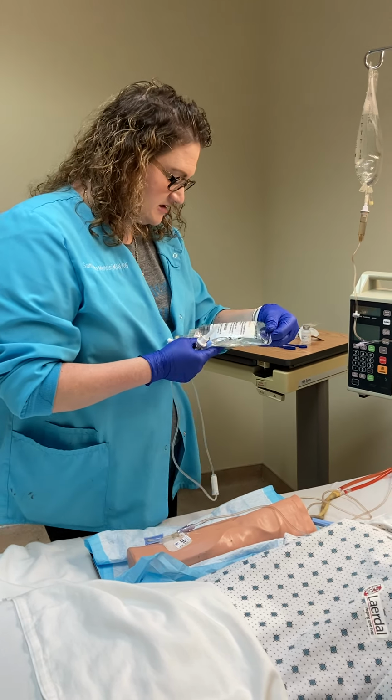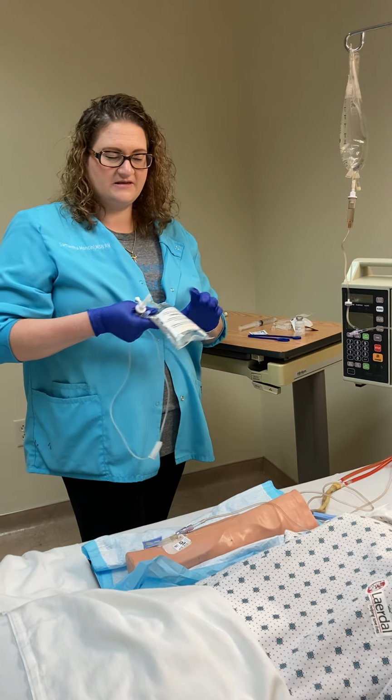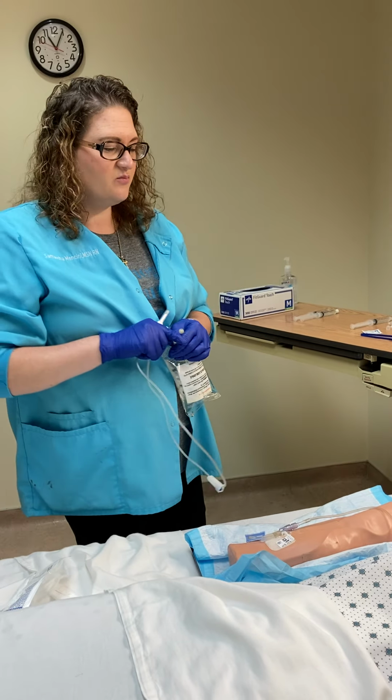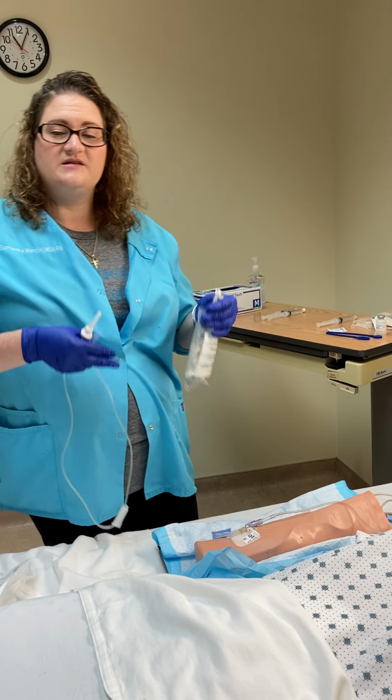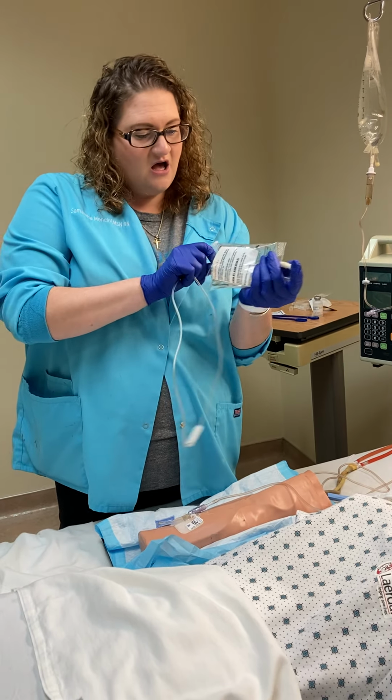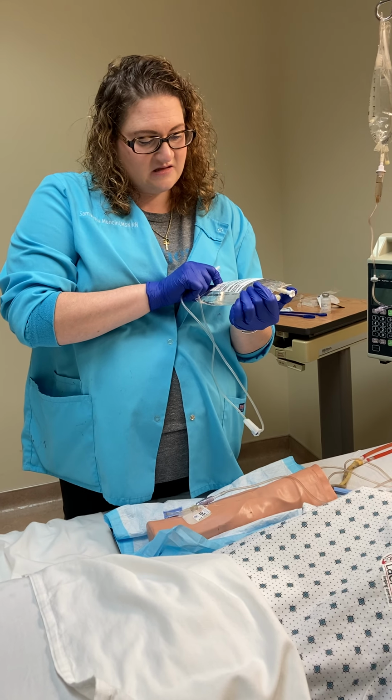So I'm getting this all set up. I got my supplies and I'm going into his room. I get Mr. Walking Feather's name and date of birth, check for allergies. He doesn't have any. I ask if he's ever had vancomycin, and he said yes, this is his 3rd dose.